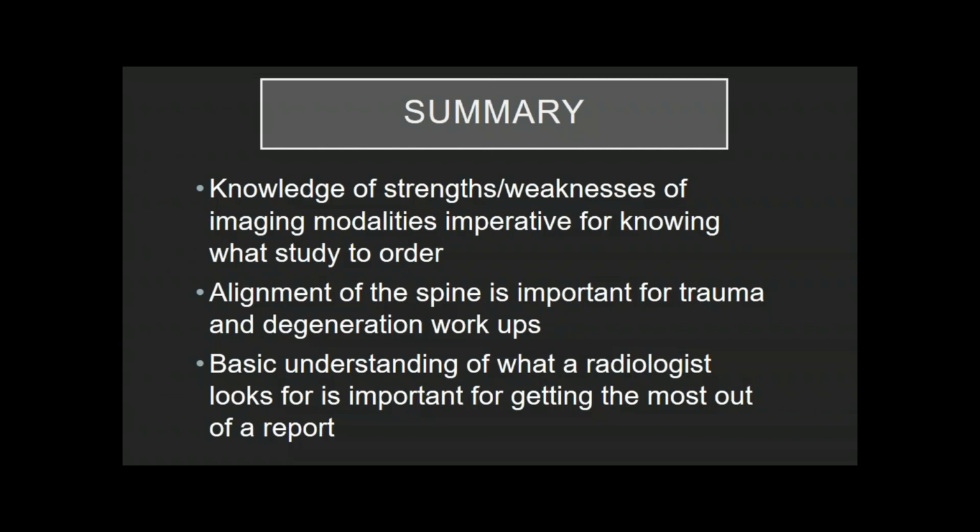So when I say layering into the spinal canal, it means the infection itself has actually made it through. It either started within the subarachnoid space or made it through the dura into the subarachnoid space to the point where it's now actually along the spinal cord itself. So it is in a different compartment of the spine than outside of the canal. It's now inside of the canal, and that's how it's able to layer along the spinal cord. So yeah, the same compartments in the brain are also in the spine, and that's why it's really important for us to be able to say what compartment the infection is in.